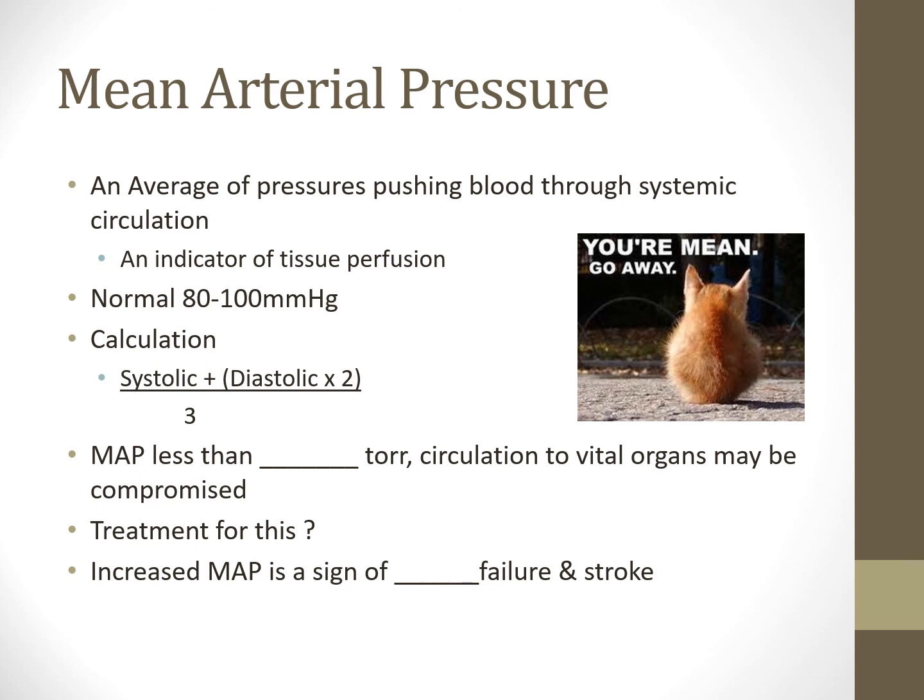So these are things that you need to pay attention to. If you're a critical care RT, you need to be paying attention to this. You cannot just look at the ventilator and call it good. You are part of the care team. This is important.